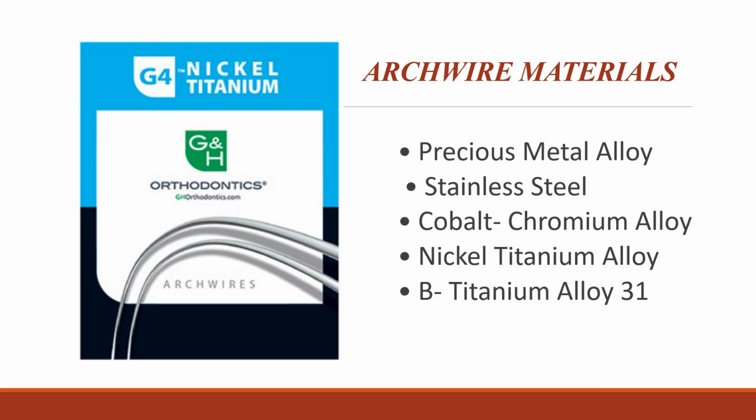During the later stages of treatment, the process of overbite reduction is completed, and if necessary, space closure is carried out by moving blocks or individual teeth, either along the arch wire with sliding mechanics under force provided by auxiliaries, or with the arch wire under force provided by closing loops.